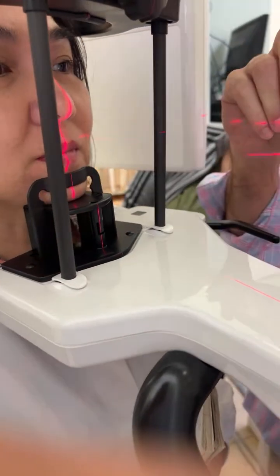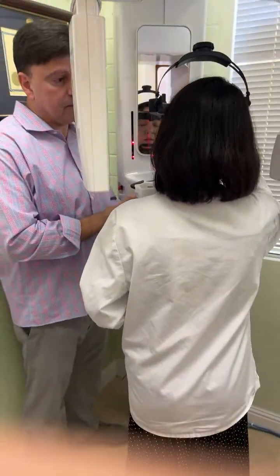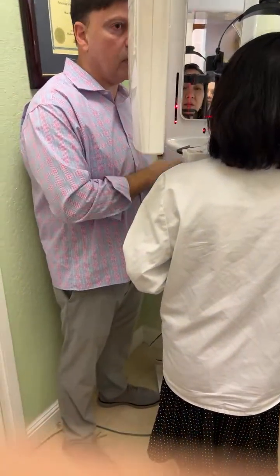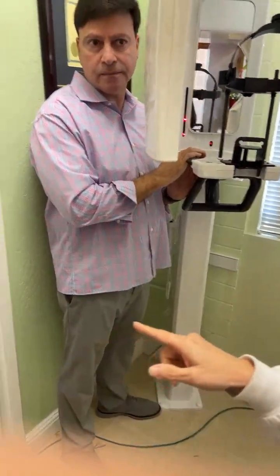Of course, it's not set up for this. It's not green, is it? No. Because you selected maxilla. But what if I select both? Then this upper line should go up higher, right here, right? Yeah, it'll go up higher, depending on what you want. But right now, it's not green because you've selected maxilla. Very smart. It detects for us.